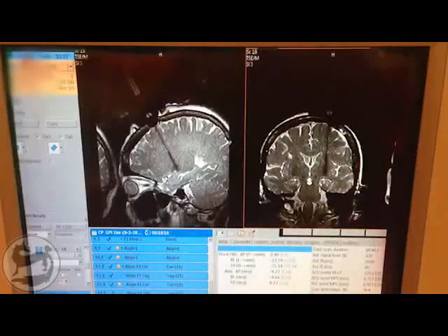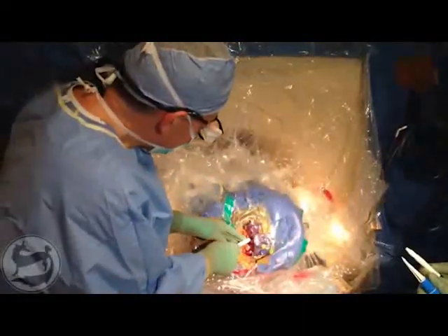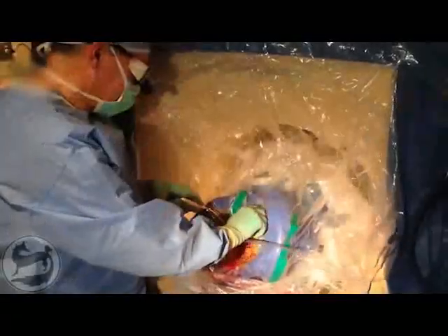Once at-target scans are completed, the DBS lead is opened and inserted. The patient is moved to the back of the bore for the removal of the smart frame components and the securing of the lead. After the Stimloc cap is placed, the wound is copiously irrigated and closed with sutures and staples.